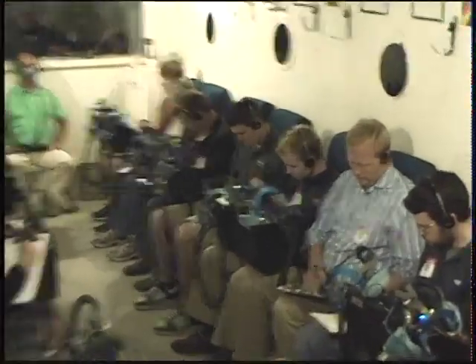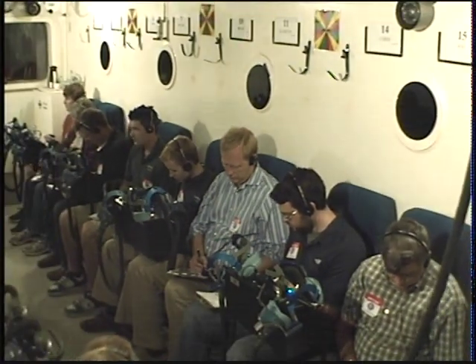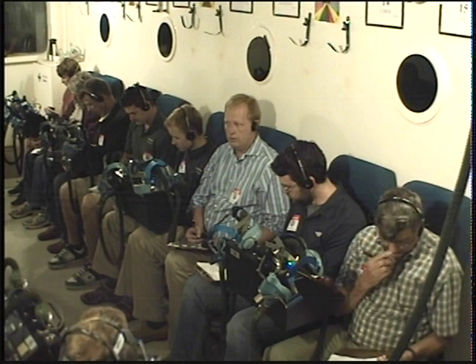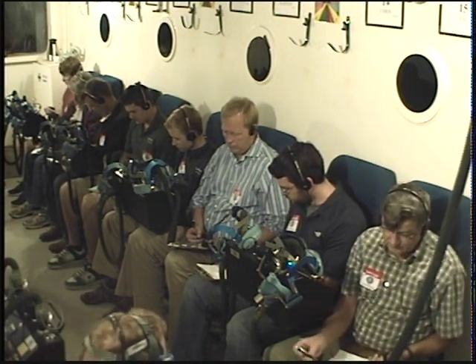All right, Brian's side, do you notice any difference in the individual sitting across from you? Have they slowed down at all? Is their breathing rate increased? Maybe you notice a difference in their skin color. Maybe they're getting a little cyanotic. Maybe that coal-ish, bluish look.